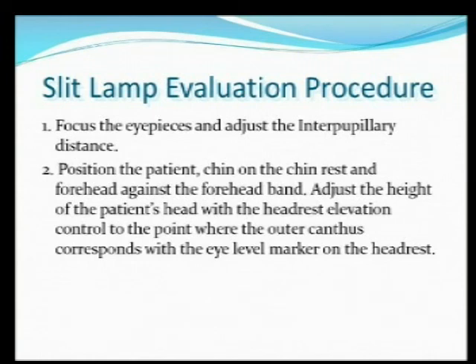However, in some offices, if it's one person that's been using the slit lamp all along, they may have misplaced it. If that's the case, it's worth taking a little time and creating your own focusing rod. You can use a straw, a wooden dowel, or something that'll fit in there, and just use a Sharpie to make it black. You can use that to focus your eyepieces, and I think you'll find it easier to pick up subtle changes.